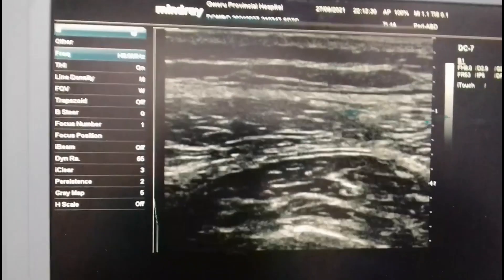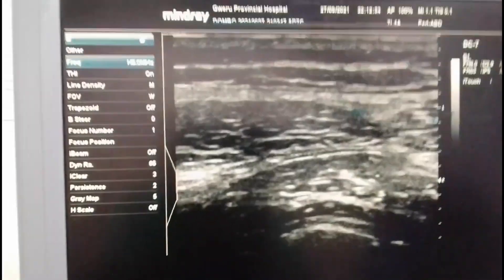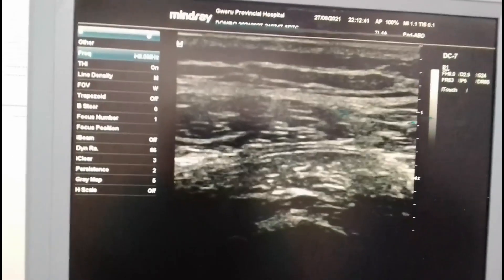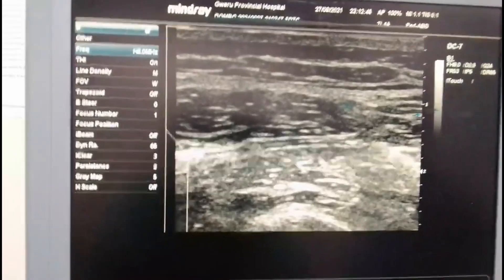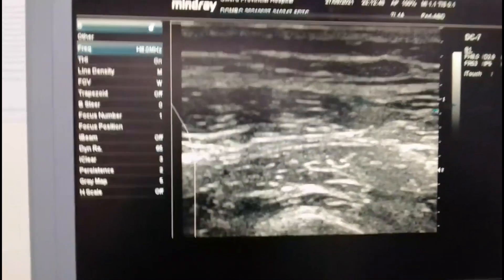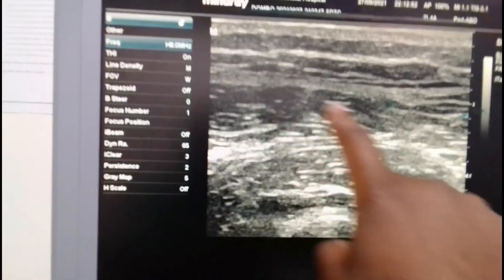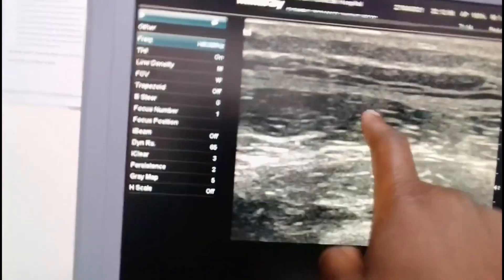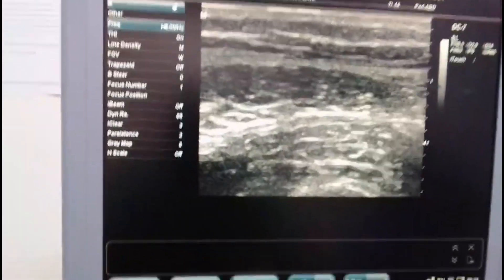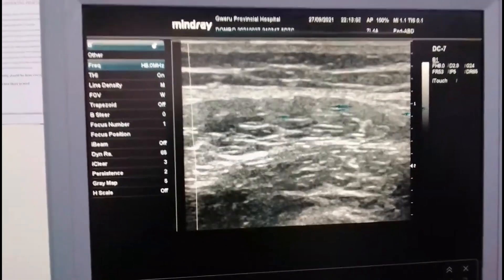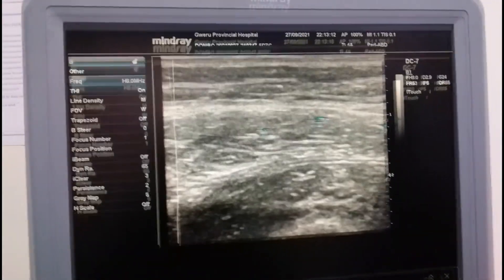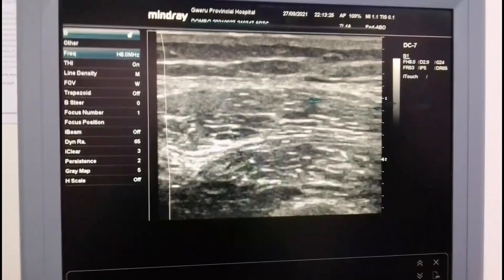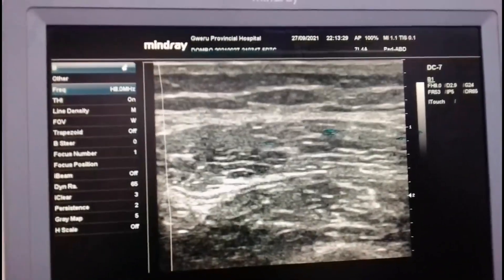So this is what we refer to as time gain compensation. You have to move the keys as you are doing the scan from structure to structure, trying to find where you get the best image. If you leave the alignment wrong, you can see I am introducing an artifact here at the center — it is looking like maybe a free fluid collection with some internal echoes, which is actually artifactual. The value of time gain compensation is that it clears this, and the image becomes more homogeneous.